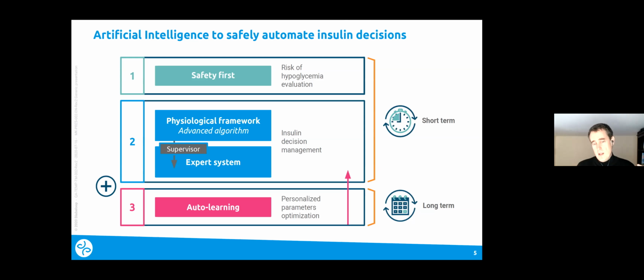And then we've got self-learning, long-term self-learning. That's going to be looking at weeks' worth of data. So the short term is every 5 minutes. Long term is looking at weeks' worth of data and optimizing your own rhythms: nights versus days, weekend versus week. In the future, we will have a special module for women's rhythm, because hormones during the menstrual cycle do have a significant impact. It's also different for most people.